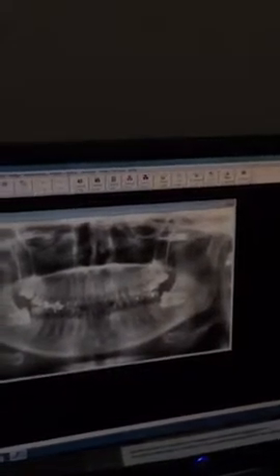As far as image enhancements, they're all in here, and I will not go through all of these. They're pretty self-explanatory by the name. From the enhancement menu, there's a lot of different things that can be applied, and SSI enhancement doesn't work very well for panos. We can have additional training, and if you have questions, I'll log in remotely and we'll go through this and explain it further. But to answer your question, if the image quality isn't what you desired, besides a few features in the software, a retake would be required.